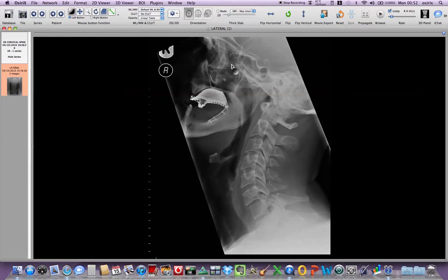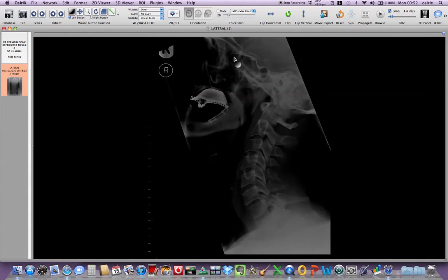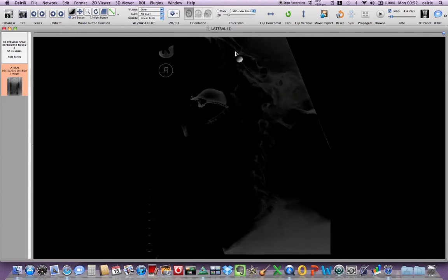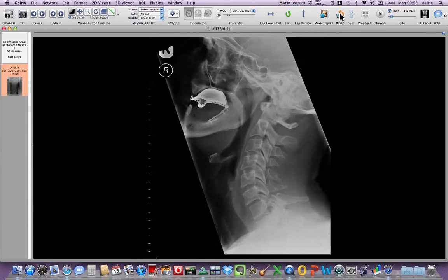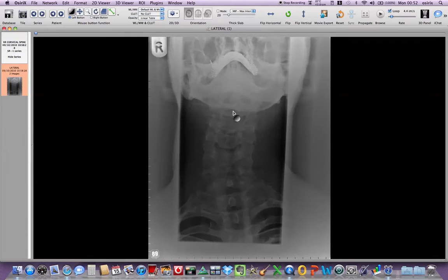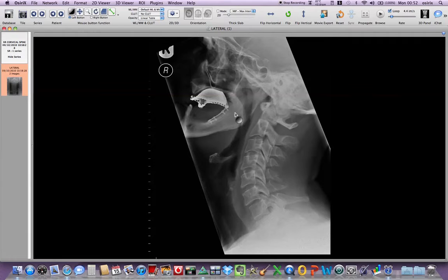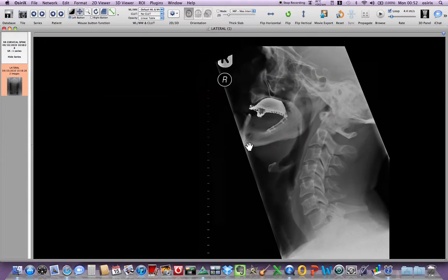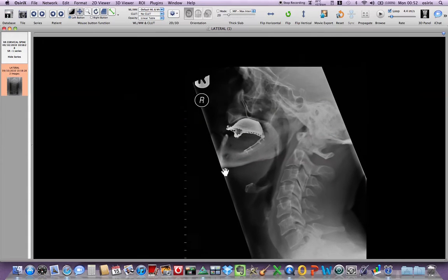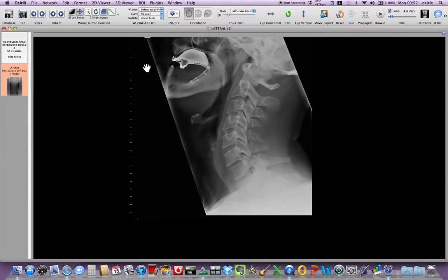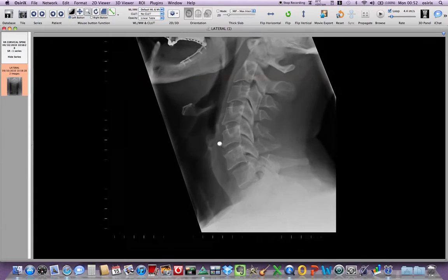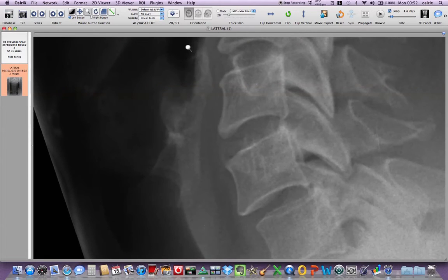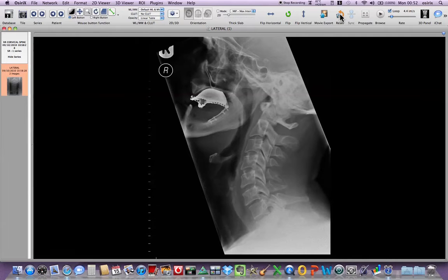Just do that again, so you can't really see the image, reset and brings it back to normal. If I use this button I can move the image around the screen, which is quite useful. I can magnify by using the zoom button and then easily restoring it by pressing the reset button.